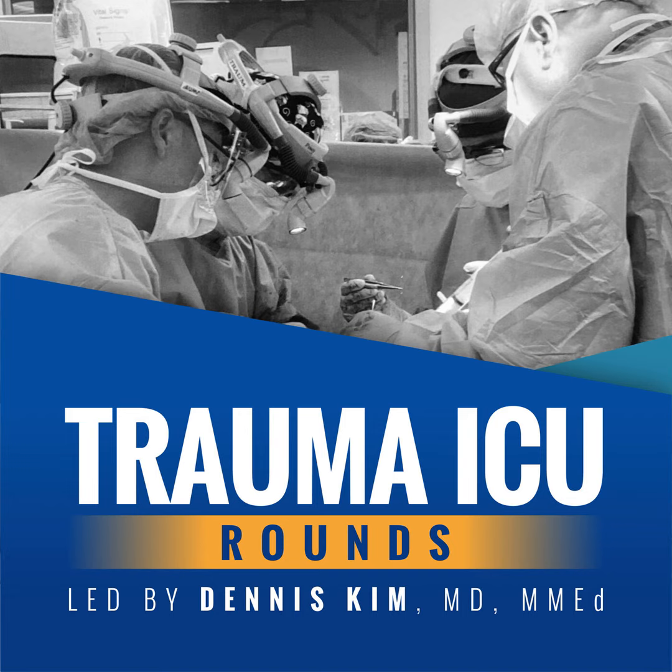Again, this may have been more important or relevant when we weaned patients. In general, these days, if patients meet the criteria for an SBT, they go onto an SBT, they get a quick assessment, and in 30 minutes or 120 minutes, we're going to make that decision: extubate, yes or no.